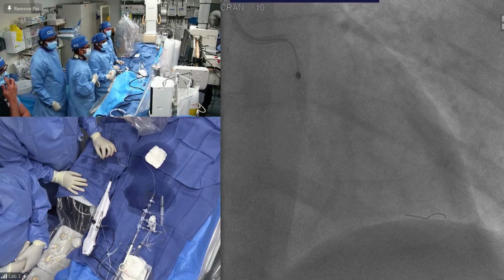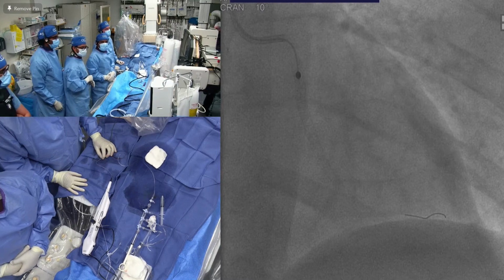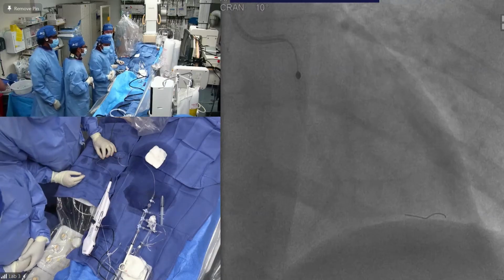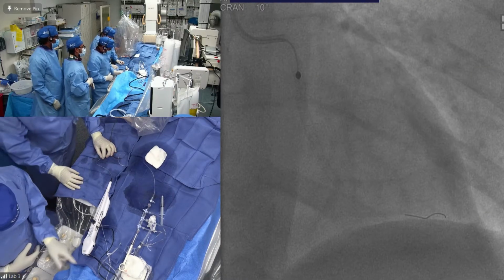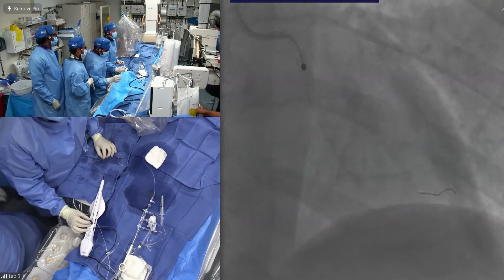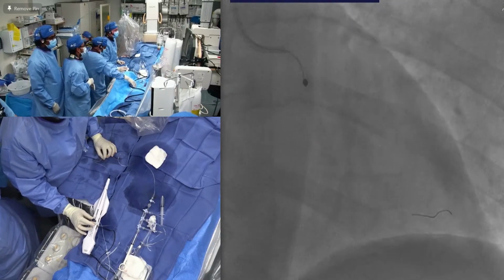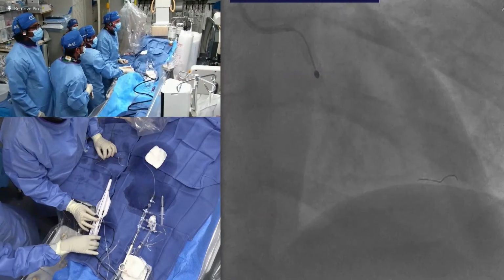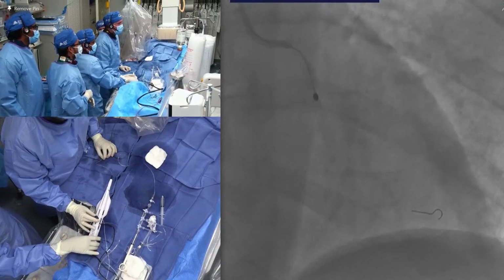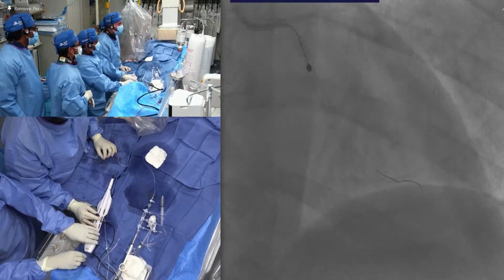I think a question that needs to be explored is whether drug-coated balloon will work on calcific lesions, because it's like putting a cream on a piece of stone. I don't think the cream will be absorbed. You still have to do atherectomy and then put the balloon. We're gonna restart now. We have a heart rate again. Continue. And the key here is not to hit the strut, the rota strut. It'll take us some time. This is a problem. Don't get too excited. It will take some time. And see, I keep changing the wire position.